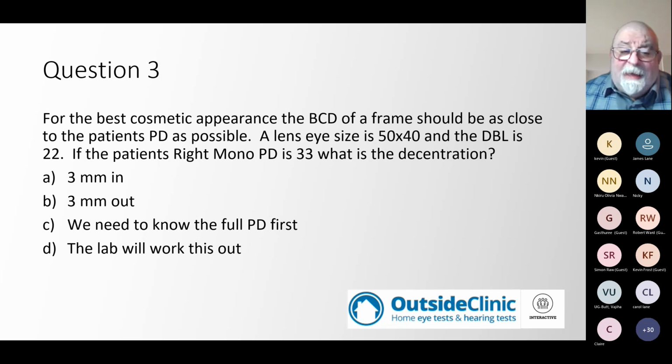Should we have it as in or out? Well, this is a personal preference. I don't like to see the eyes in the outer half of the frame, because to me that always looks as though the frame is too small. So in an ideal world, we would like the decentration to be inwards.